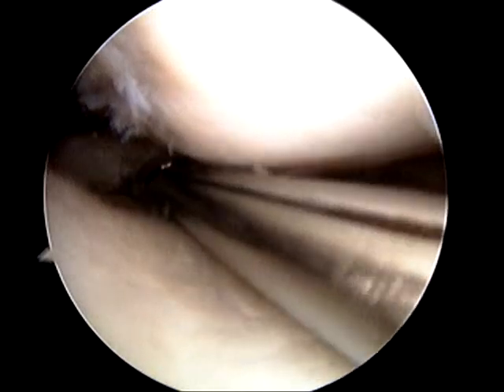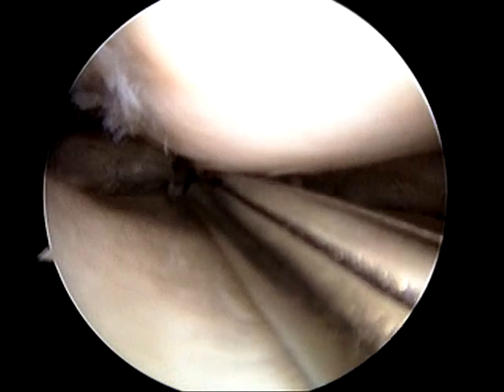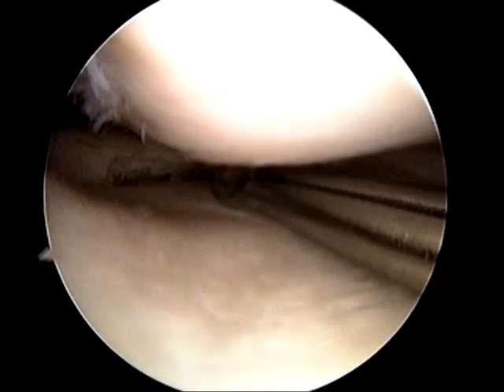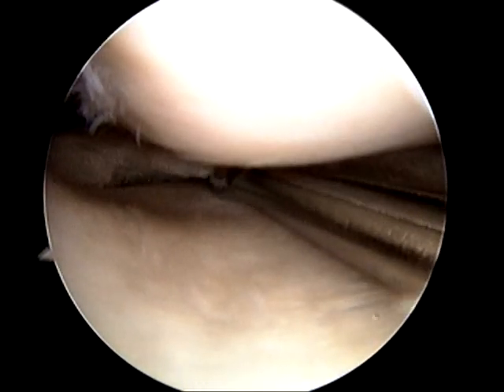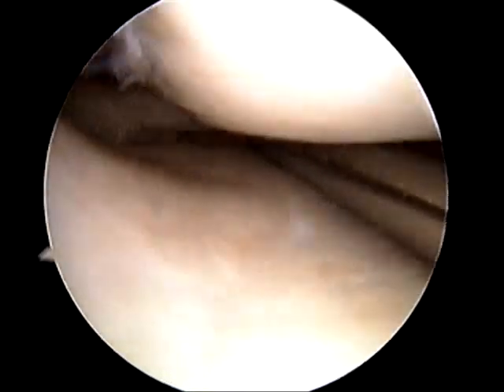Once the fragment has been removed, a biter is used to smooth out the rough edges. It is important that the rough edges be removed to prevent any propagation of the tear after the procedure has been completed. Often this will leave debris in the knee, and therefore a shaver is introduced to remove the debris and further smooth out the rough edges.